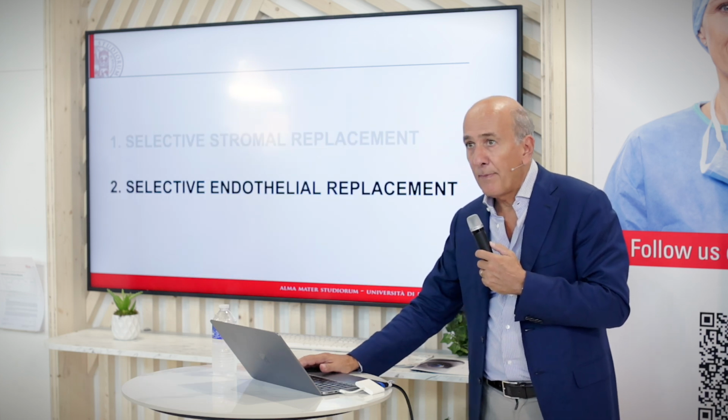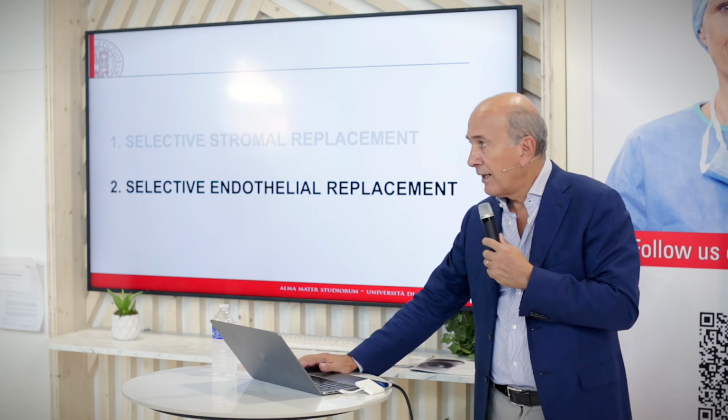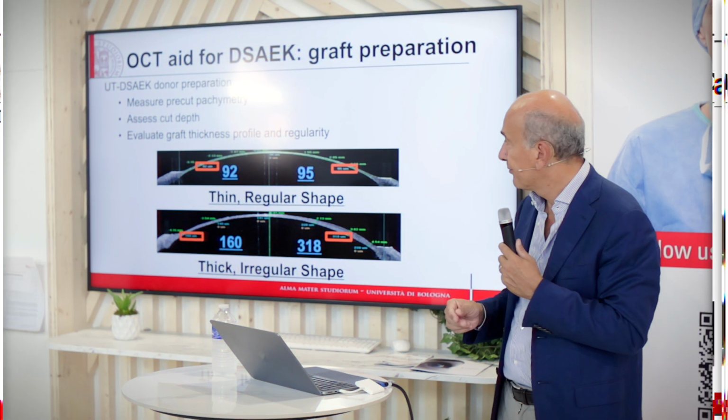Now, how about endothelial keratoplasty? How could the intraoperative OCT be useful for a DSAEK or a DMEK? We all know that in terms of DSAEK, the quality of the donor is absolutely fundamental in order to achieve a good result in terms of visual acuity.